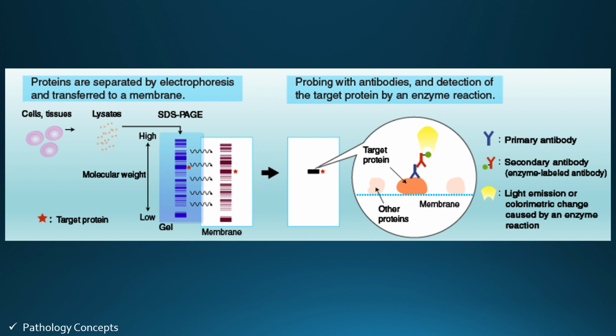Let's learn how the HIV Western blot strips are made. The HIV-1 and 2 Western blot is manufactured from the HIV-1 cell line. The HIV-1 viral antigen is purified and then separated by SDS gel electrophoresis. The SDS denatures the viral components and yields proteins which migrate in the gel according to their molecular weight to produce various bands. The low molecular weight components migrate faster and are found at the bottom of the gel, while high molecular weight proteins remain near the top.